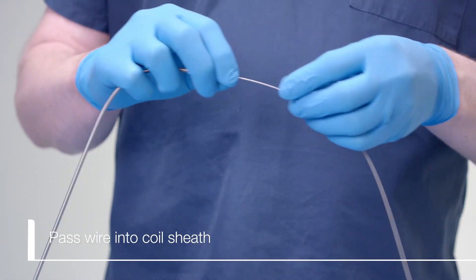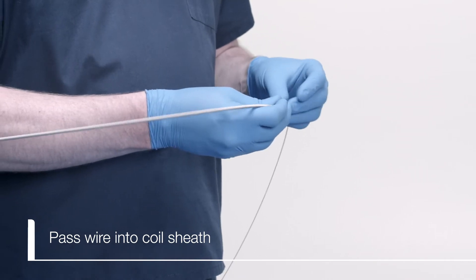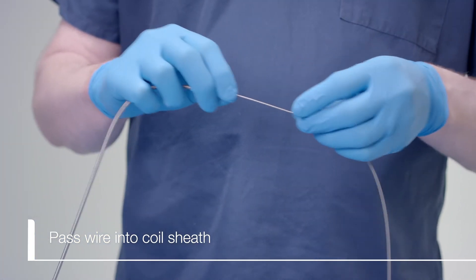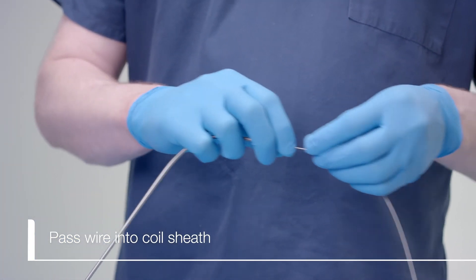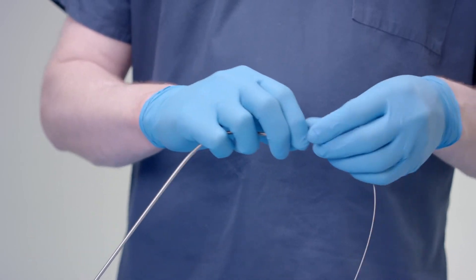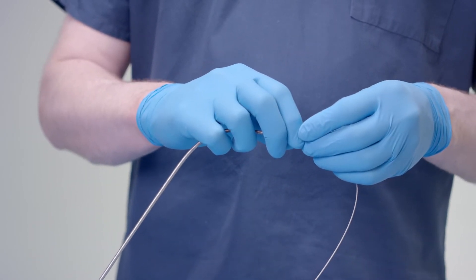The stem and basket wire are now loaded into the coil sheath. The wire is advanced through the unmarked distal end of the sheath. The end with the green band is the proximal end and is connected to the handle later on.